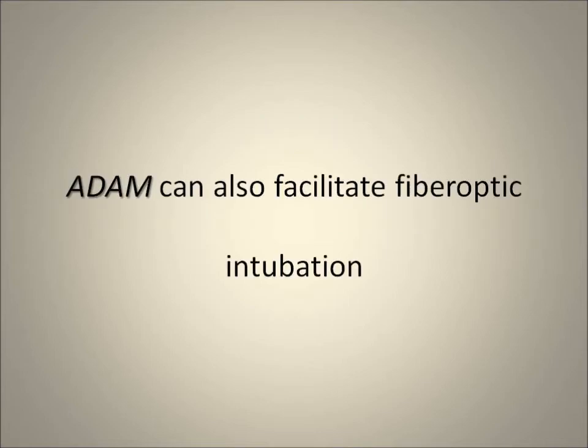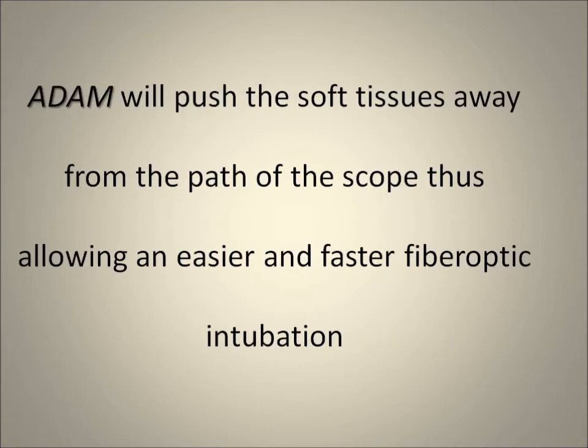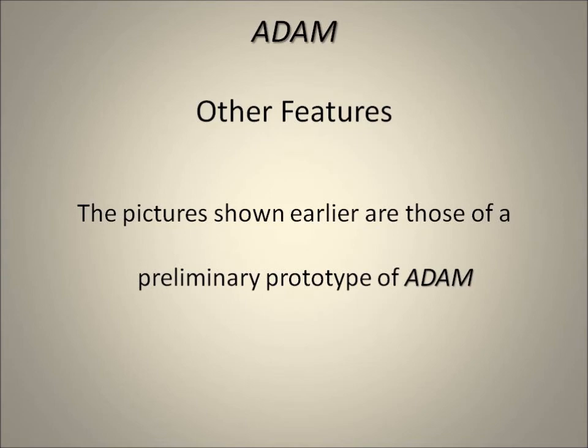ADAM, Assisted Fiber Optic Intubation. ADAM can also facilitate fiber optic intubation. With ADAM in place, a fiber optic scope can be inserted through the tube while ADAM is allowing intermittent ventilation. ADAM's other features. The pictures shown earlier are those of a preliminary prototype of ADAM.